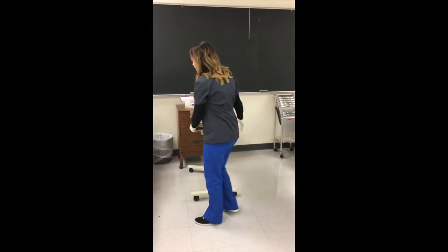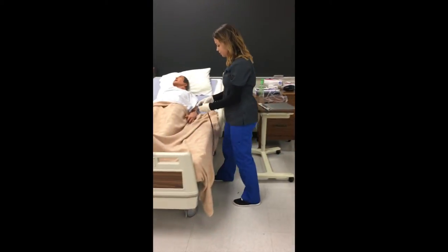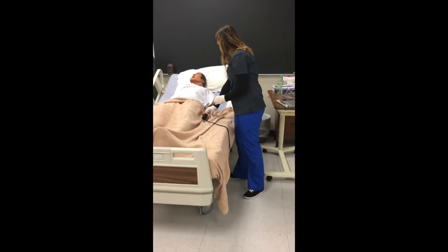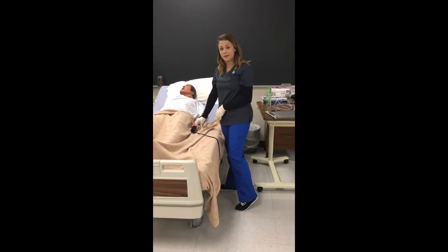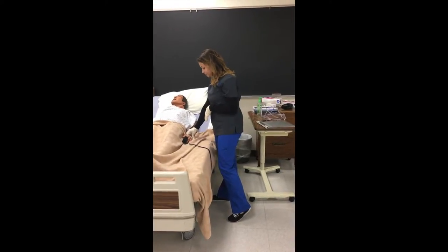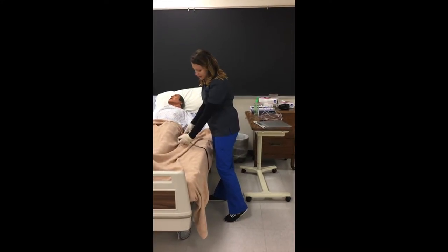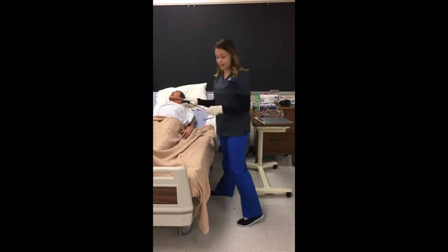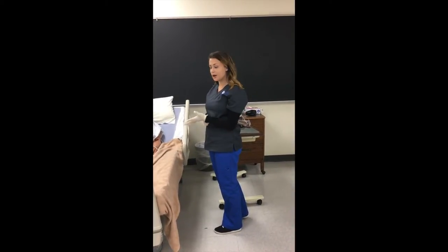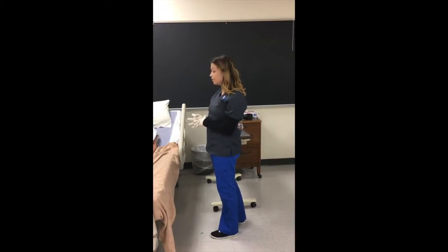Before I set up your nasal cannula, I'm going to go ahead and check your vitals. I'm going to take your pulse oximeter and put this on your finger. I'm also going to take your pulse for about a minute, and I'm also going to take his respiratory rate for a minute, but I cannot tell him that because he will change his breathing. His pulse came back normal at 88. His SpO2 came back at 90, like the doctor said. His respirations were a little high at 23, so it is obvious that he is having some trouble breathing.